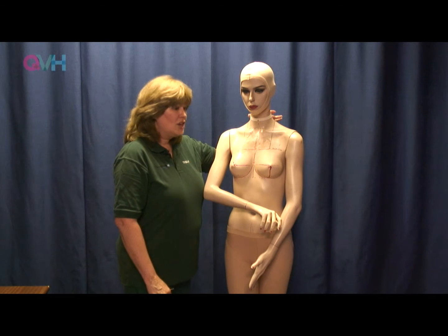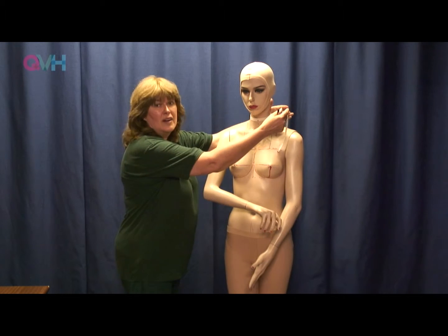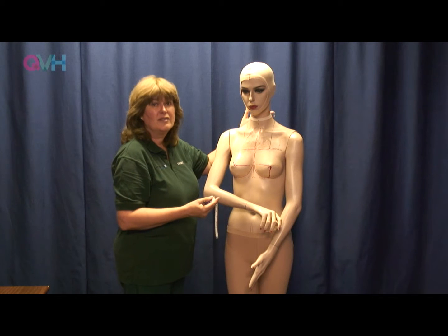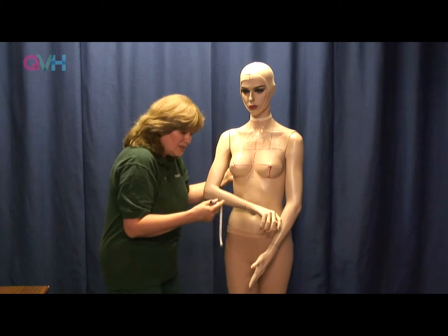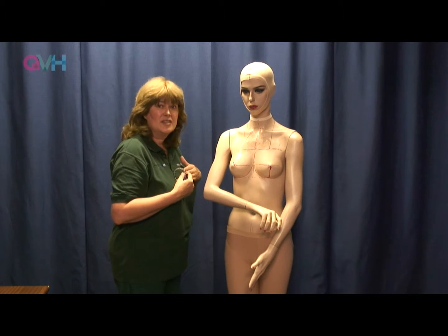Generally it's easier for a patient to stand so that you can get the tape measure around them. There are times when you have to measure them lying down, and times when you have to measure them sitting down, but people tend to crunch up when they're sitting and you tend to get different distances.